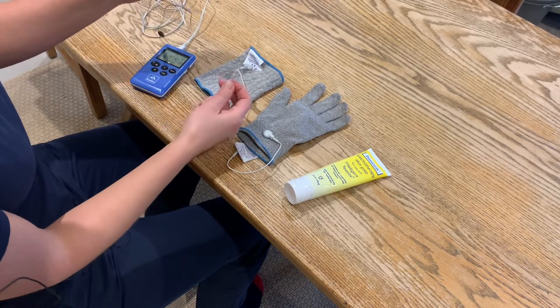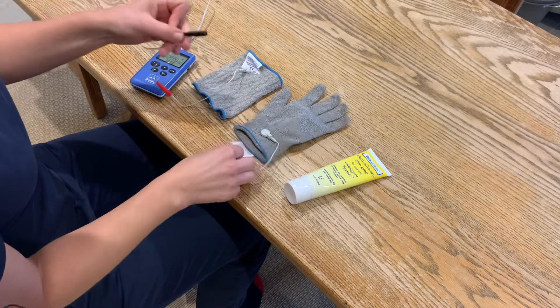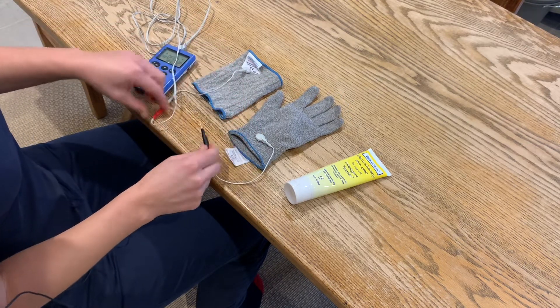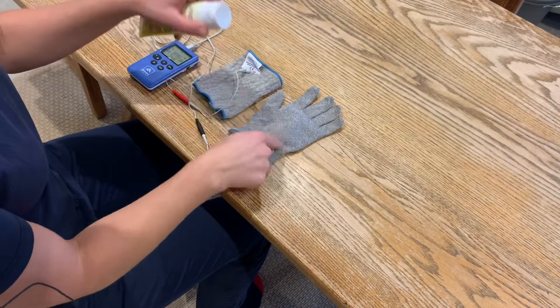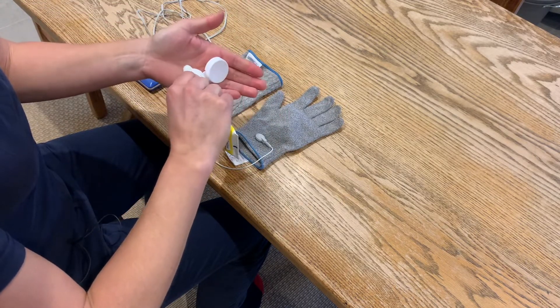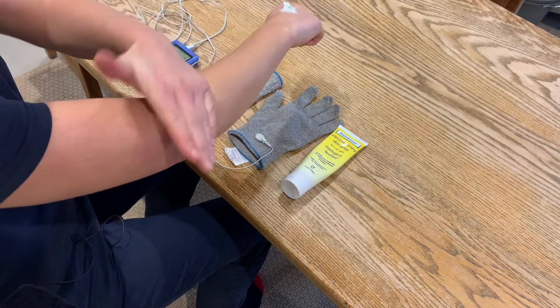Then connect the red and the black to your leads off the garments — it doesn't matter which way around with the red and the black. You need to use the conductive cream where the garments are going to sit, so a generous amount on your hand and on your elbow.